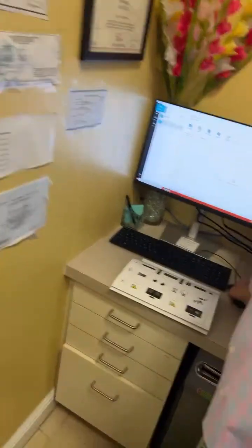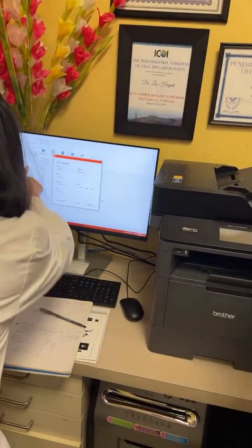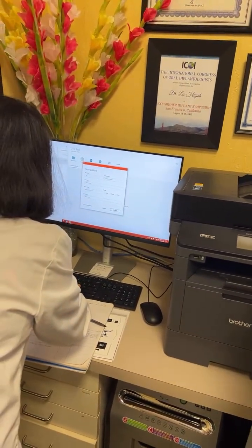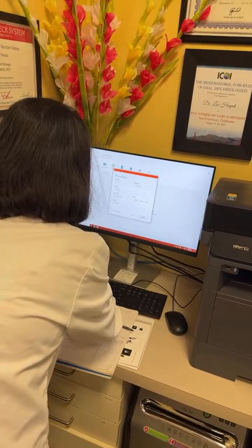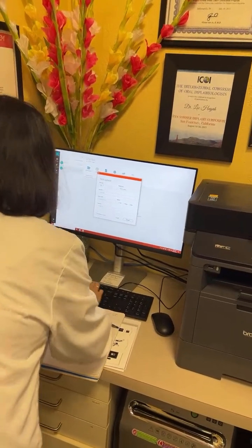So you're gonna go in here and hit plus, create patient, and you're gonna enter in this data. The name. Can we use another patient or no? No, you only have two in there. You can link from Eaglesoft. So you're gonna take an X-ray. Let her fill it out so she remembers. Go ahead, Denise.